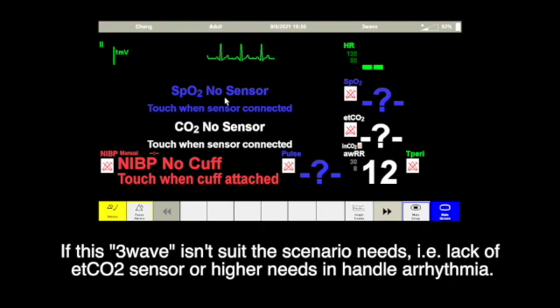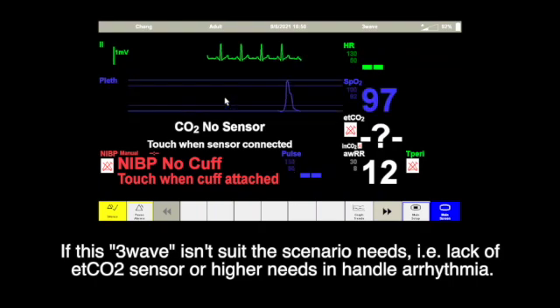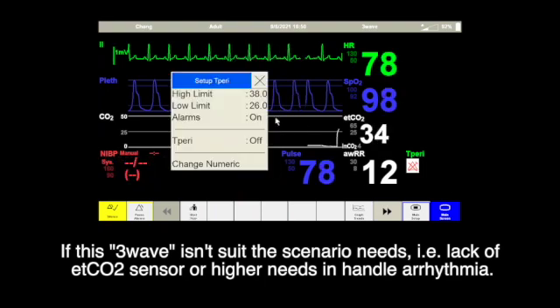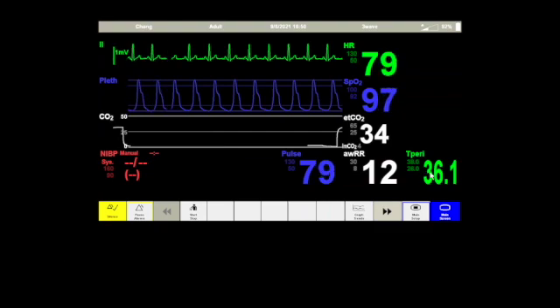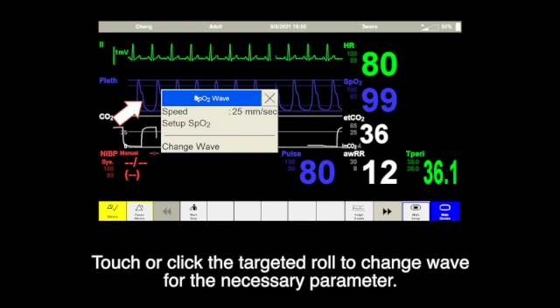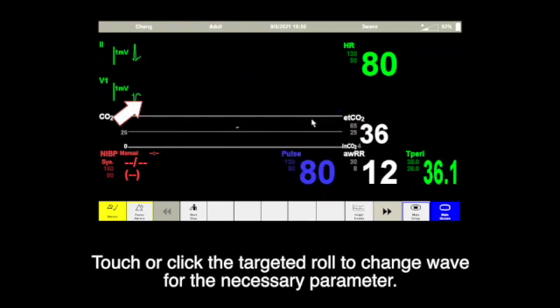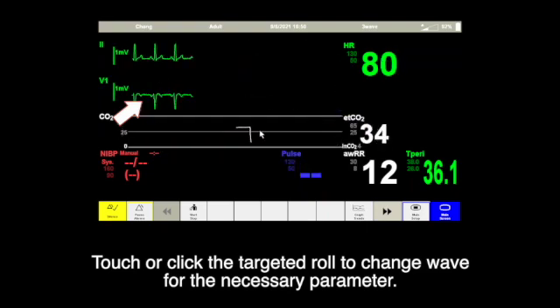If these three waves are not suited to the scenario needs — for instance, lack of ETCO2 sensor or higher needs in handling arrhythmia — touch or click the targeted row to change the wave for the necessary parameters.